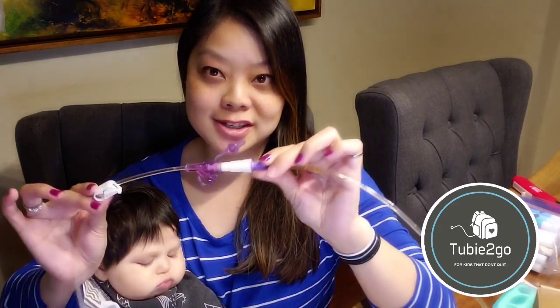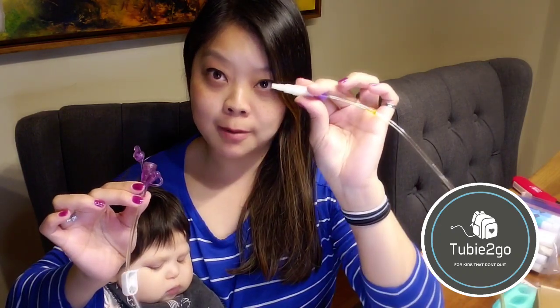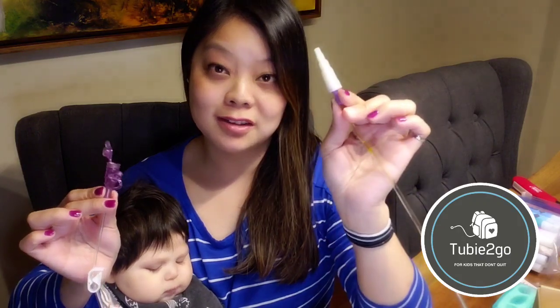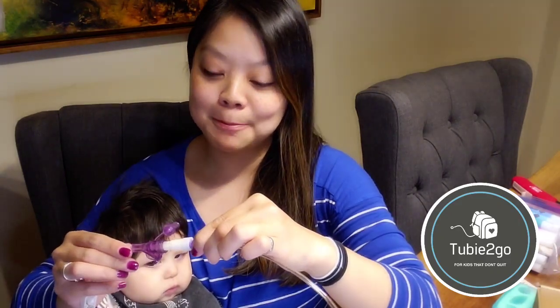Well, feeding the bed typically means that your feed extension and your feeding bag tip have come apart, and instead of the food going from your feed bag into your Tubie's tummy, it is now leaving this feed bag and being sprayed all over wherever you're feeding. For many parents who have tube feeders who have to feed continuously overnight, that means that they have now fed the bed and come back to a disaster in the morning, hence the coined term of feeding the bed.